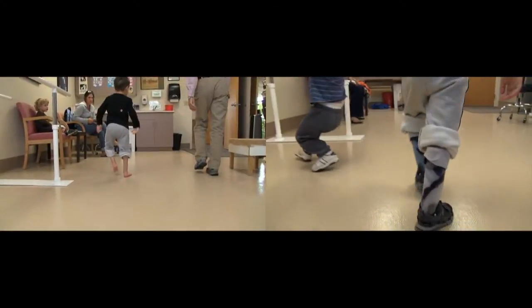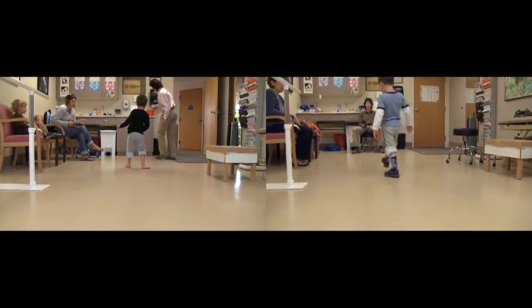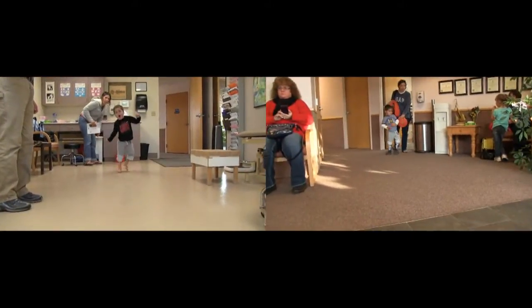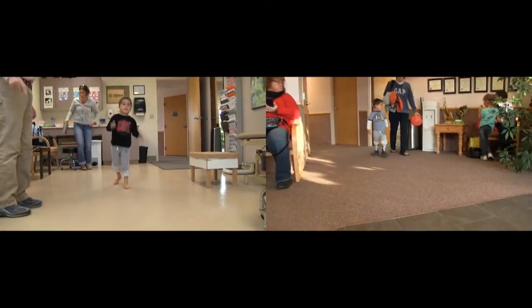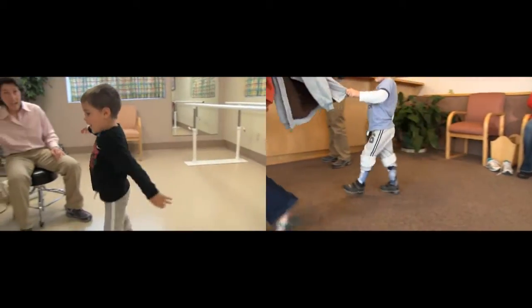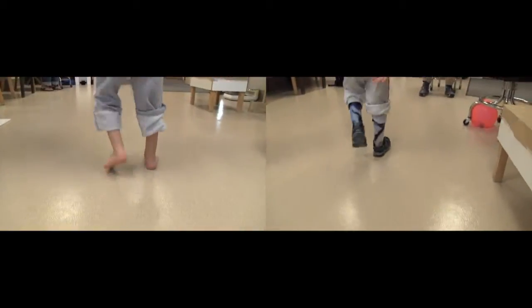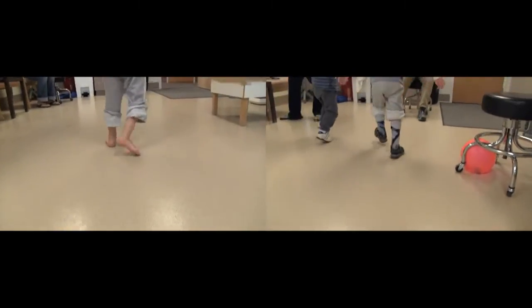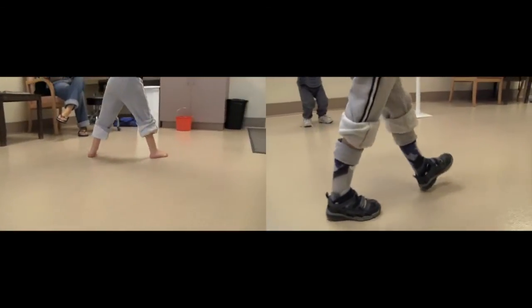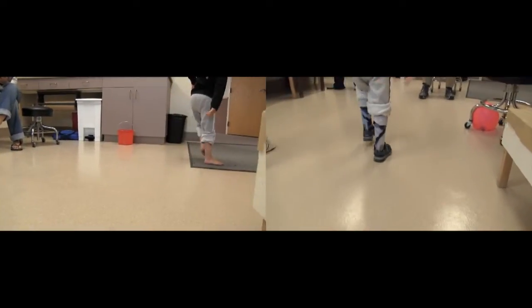Here Jackson is walking with and without braces — you can see the two split screens. There's some nice improvement in his gait. You can see he's not using as much arm motion. He is much more stable. He uses less hip movement and swivel in his gait when walking. His hindfoot alignment is significantly improved, and you do not see the flipping of the feet because we are keeping his ankles in that fixed position for good foot clearance during swing phase.